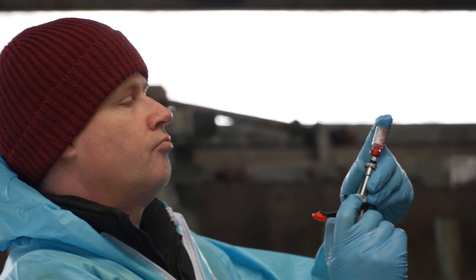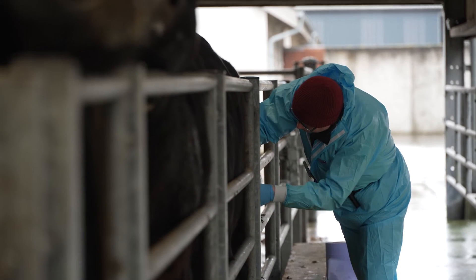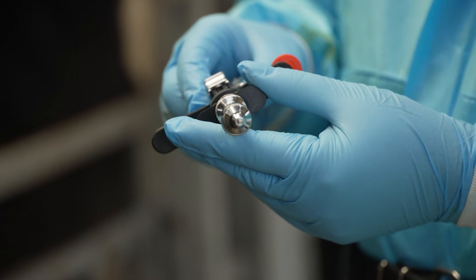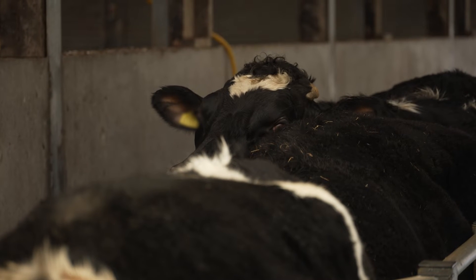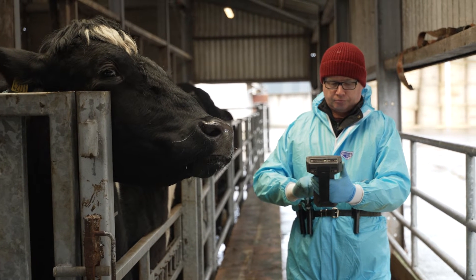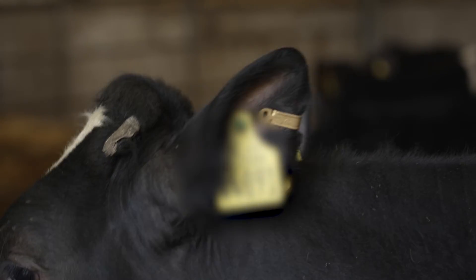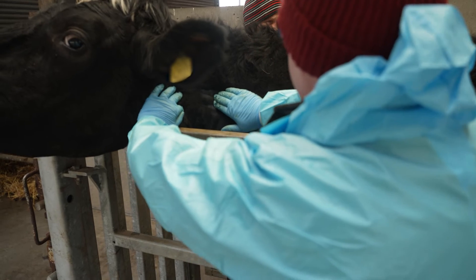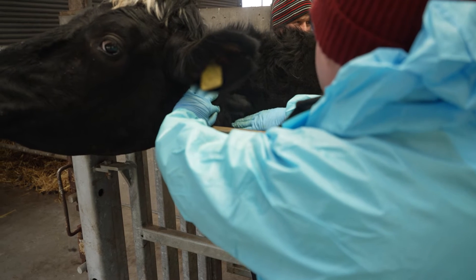It is essential to ensure that the loaded syringe is free of air and contains the correct tuberculin before commencing the test. Back spray is a recognized failure of injection and can be caused by an air bubble in the syringe; it can be recognized by seeing tuberculin on the skin. All animals to be tested must be correctly identified in accordance with legal requirements. The testing veterinary practitioner must be satisfied as to the identity of each animal and that each ear tag number is recorded in full. The side of the neck on which the test is to be carried out should be examined and palpated for any abnormalities such as swellings from previous injections or skin conditions which may interfere with the test.